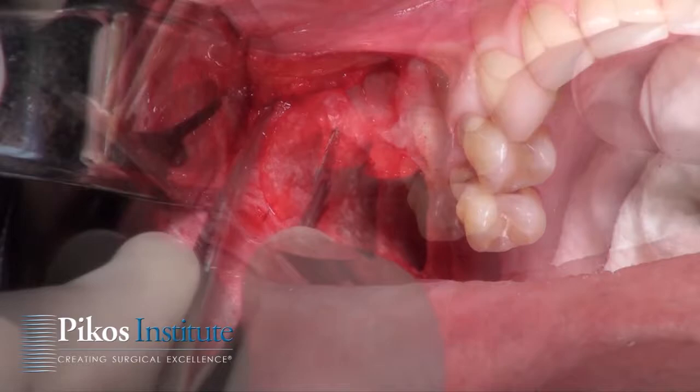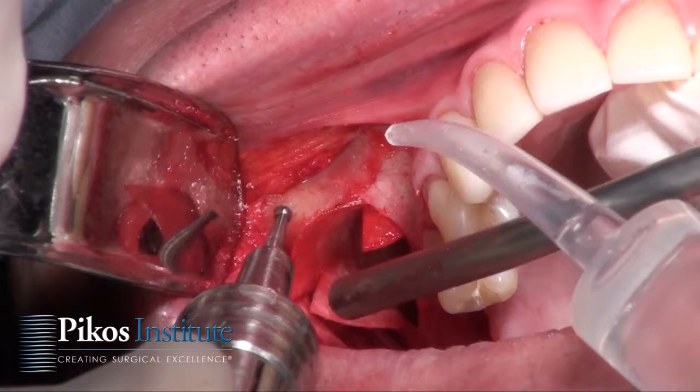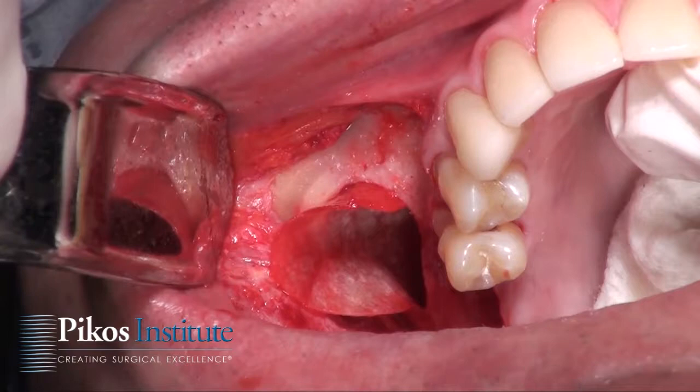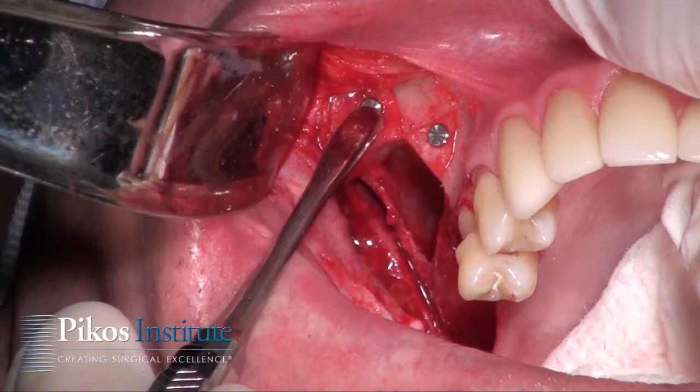In those cases I recommend using a larger membrane with external fixation — there's no concern for graft extravasation. We're now using the auto-tack from BioHorizons to place the tack; it's spring-loaded and secured. We want to make sure it's not moving — if it is, take it out and start over.